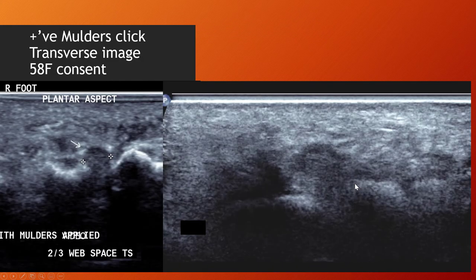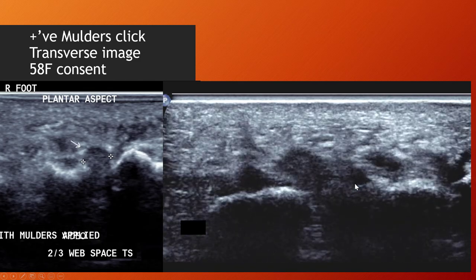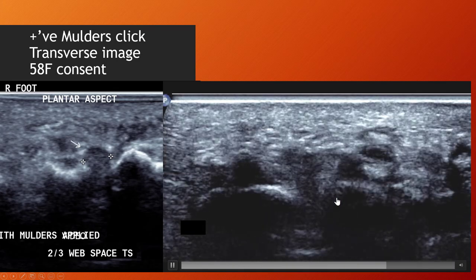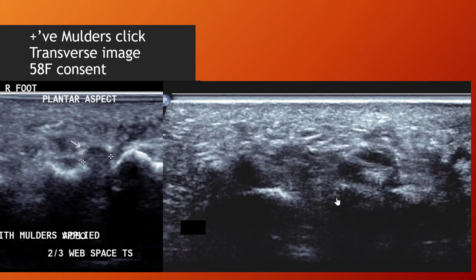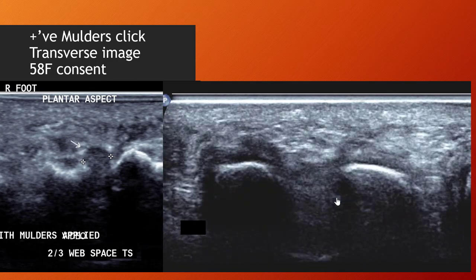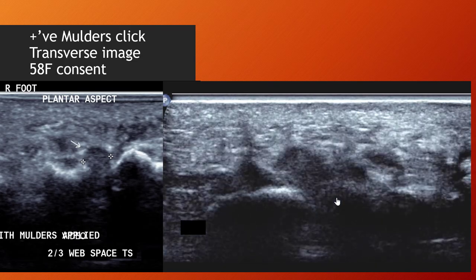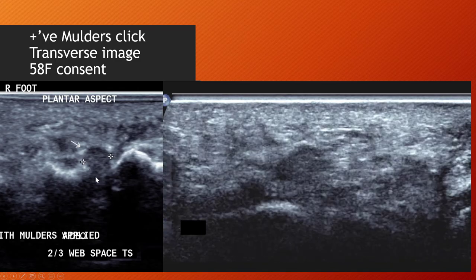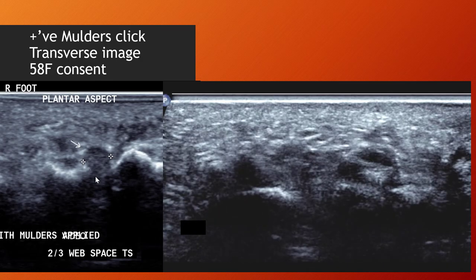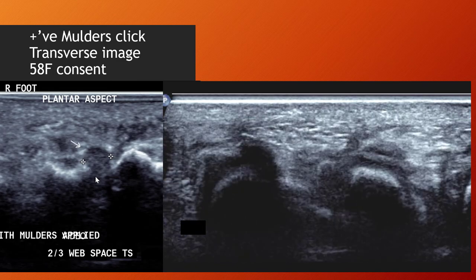So you may be asking, why not do the scan in transverse, since that's how MRI does it? So the reverse teardrop shape on ultrasound looks like this. And sure, it can be a helpful tool, but the downfall is that the probe is either too distal or too proximal and looks completely normal, and you miss the neuroma. This displacing tissue as well may include things like fat and synovial fluid as well as the nerve, so there's more likelihood of a false positive for a neuroma.